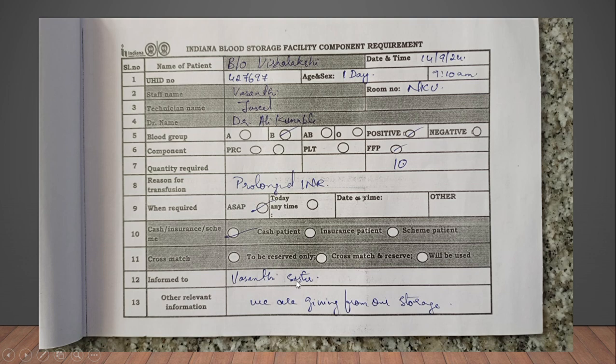whether the blood is available, not available, what exactly has to be done. In this case we only give it from our blood storage, so we inform them that we will be giving it from our blood storage facility for this particular patient.